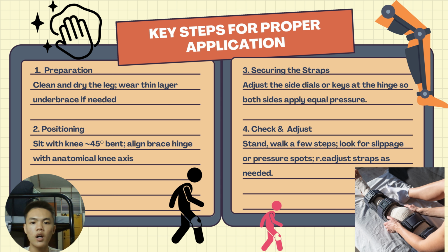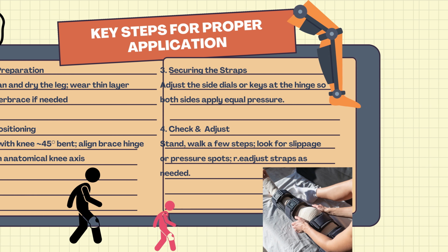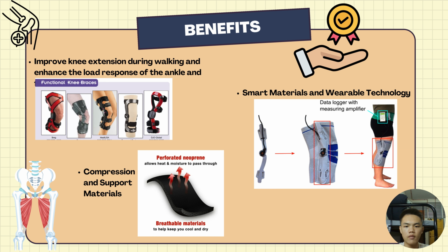Finally, stand up and walk a few steps. Check for any slipping or discomfort and make adjustments. The two-finger test is a good check. Comfortable but not too tight. Let's go through its benefits.